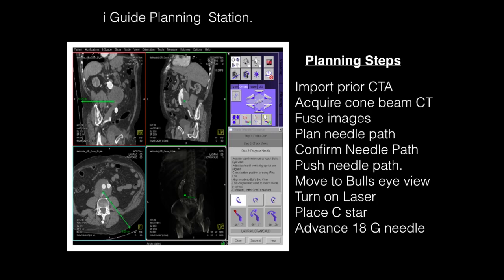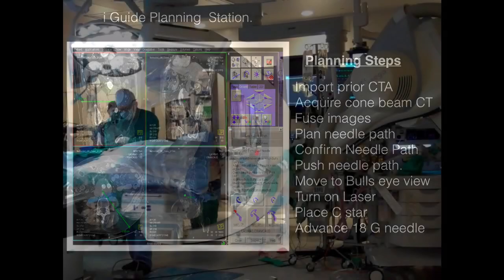This is done using a laser built into the image guidance system. We use a needle stabilizer called the C-STAR, which we'll show you, and then we advance an 18 gauge needle to the target. Now we'll take you through these steps.